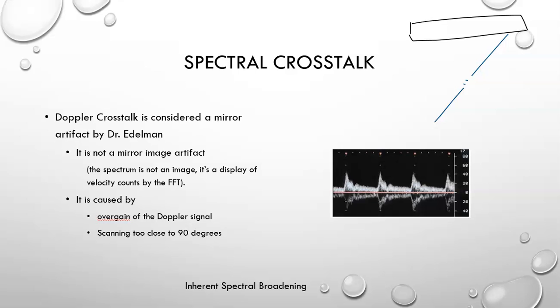Well, we know that this spectral Doppler beam that is created has to be created through the use of several microcrystals, because it's phased array. That's how we do it. We utilize several microcrystals to create this beam that's going to come down and interrogate our artery.